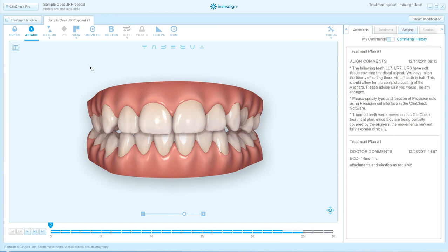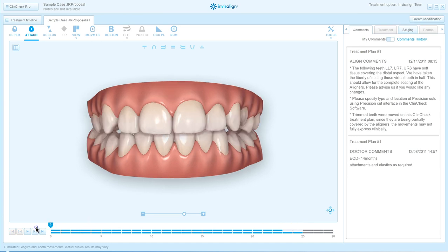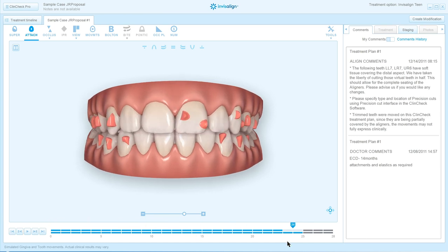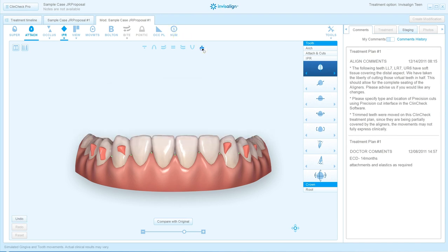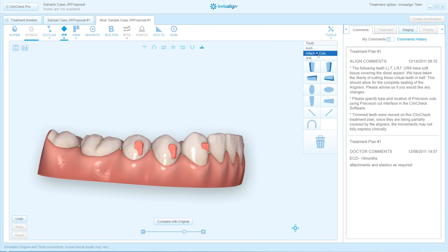Here's the first ClinCheck that I got back for Jared's treatment. As part of the treatment, there is leveling of the curve of Spee. I know that horizontal attachments are required, and the optimized attachments that appear on those teeth may not be able to give me the kind of leveling of the curve of Spee that I need, which is the first and most important thing I want to do. So in the lower arch, I have a couple of choices on the bicuspids, and I'm going to show you how I customize the attachments I choose to use on these teeth.